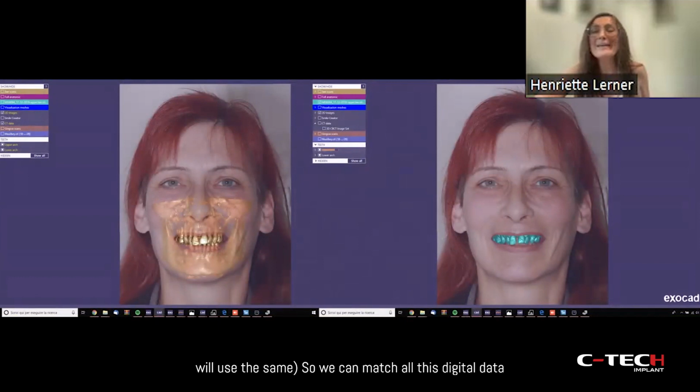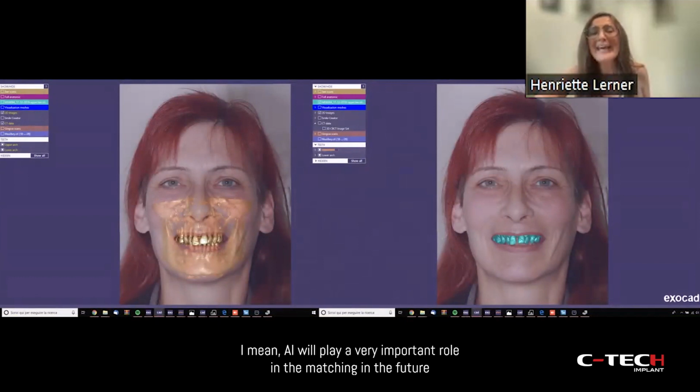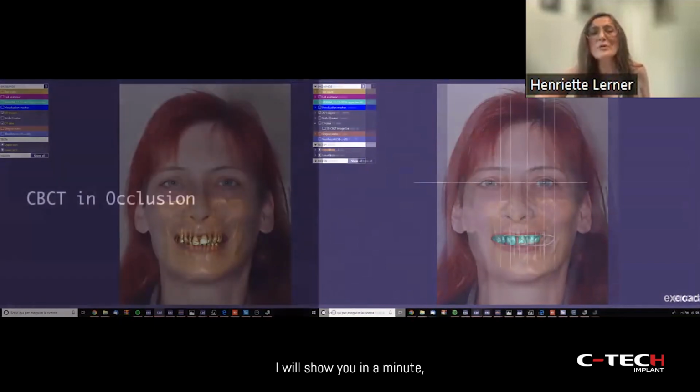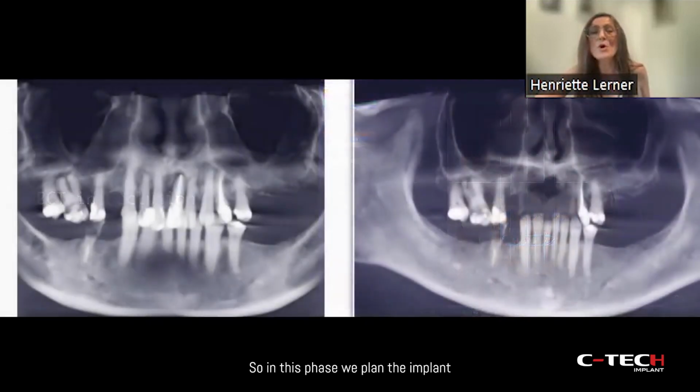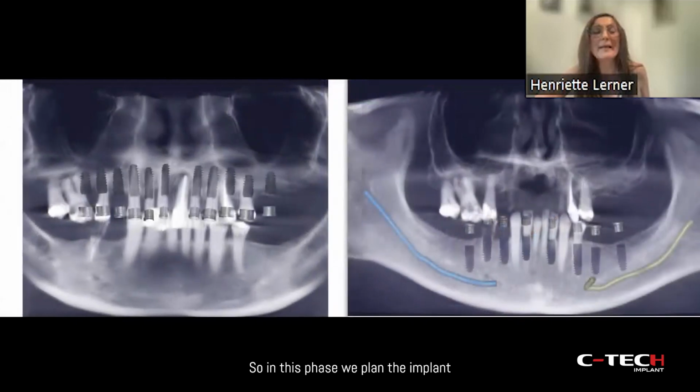So we can match all this digital data, nevertheless manually. I mean, AI will play a very important role in the matching in the future. I will show you in a minute, but by now, in this case, it was made manually. A cone beam CT. So in this phase, we plan the implant.